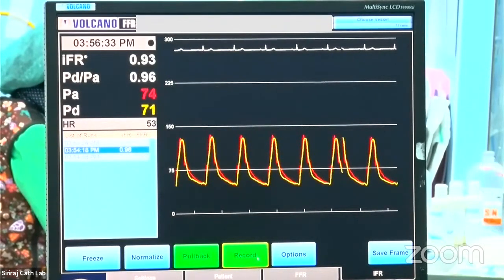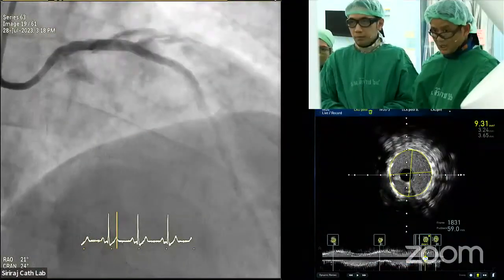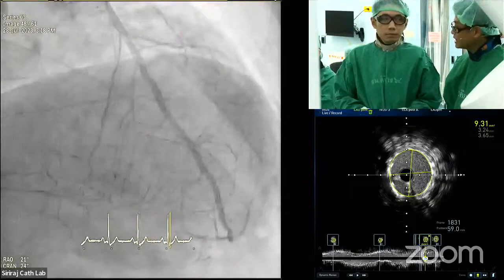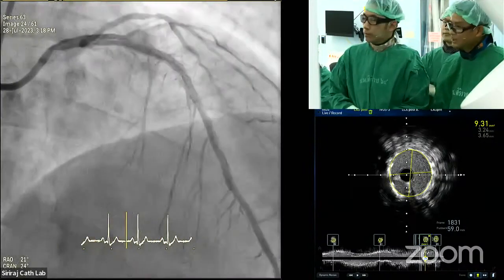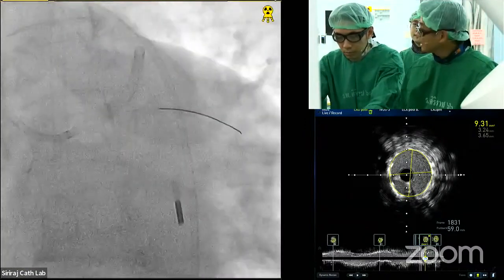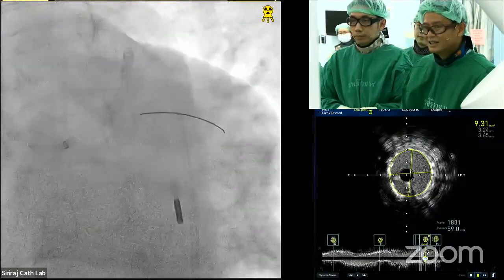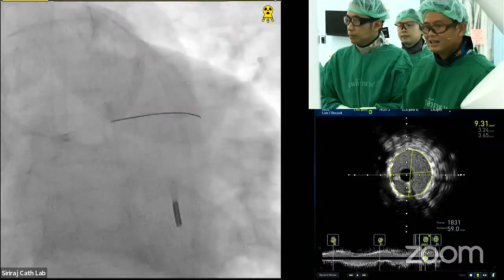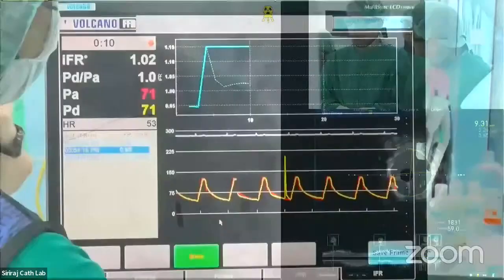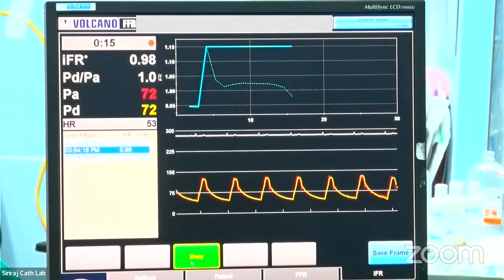And I think we will leave this. We can do the final angiogram that we have. And I think that should adequately demonstrate how challenging this is and how imaging and planning could help us. I think we can do the final angiogram and then comment. And pull back the FFR wire, validate. Pull back. Thanks, Nattawut and the team for showing us even the physiology ending there. That was actually very nice. You're going to show us a final angiogram before we close? Right, we do. Yeah. Okay, we make sure that there is no drifting. Okay, we do the final angiogram.